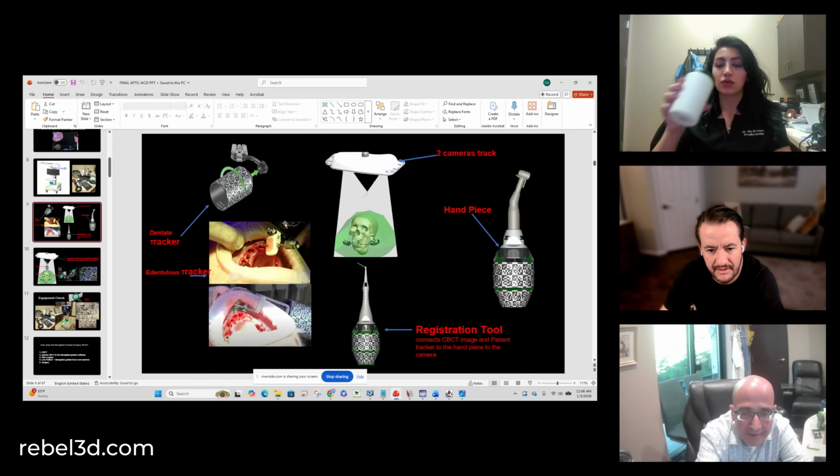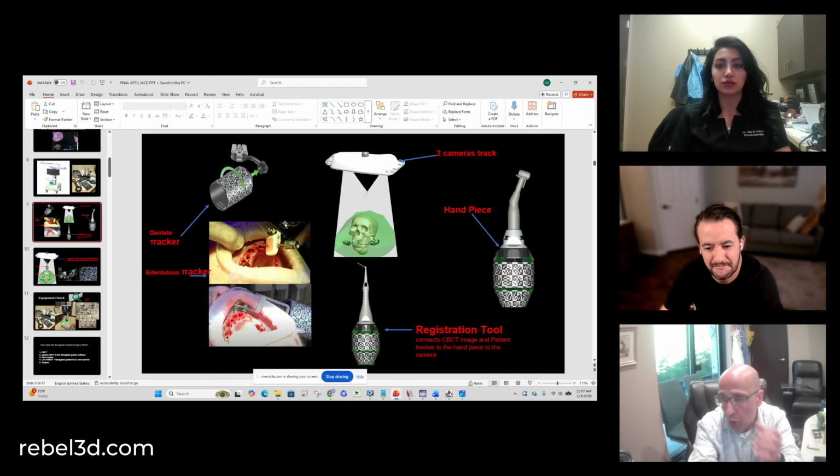And now you have the patient. I would consider this camera is my satellite. This handpiece now is your car, or I would say the steering wheel.